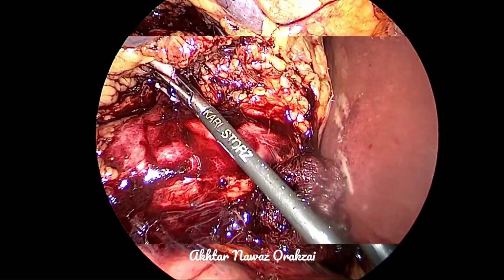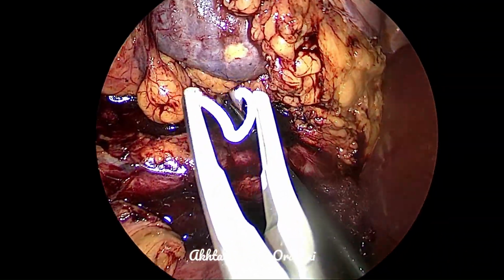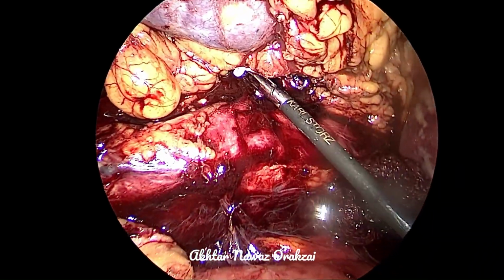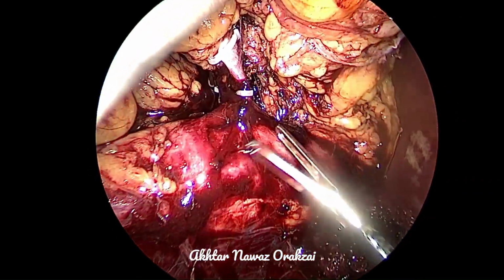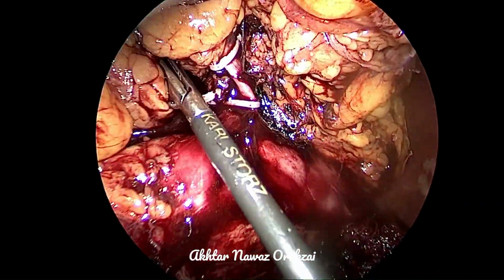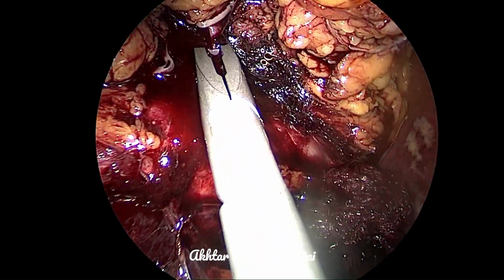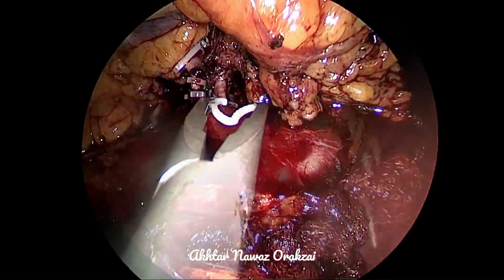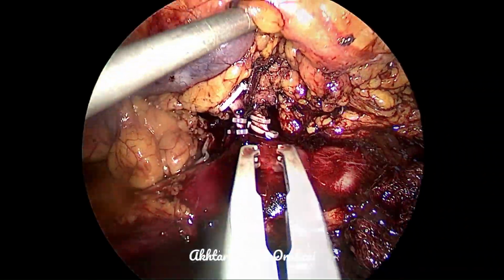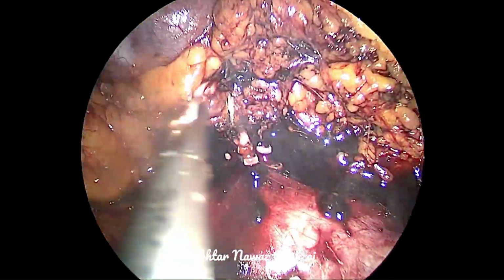Now you can see that the side of the vein towards the major vessel is secure. Now the things are in control. So increasing the pressure, number one. Number two, holding the injured vein with a non-traumatic forceps for a while. And then of course placing another 5 or 10 millimeter port has led to a success in dealing with all these difficulties. And after that the procedure ended within 10 minutes.